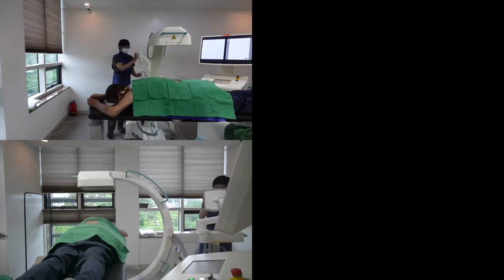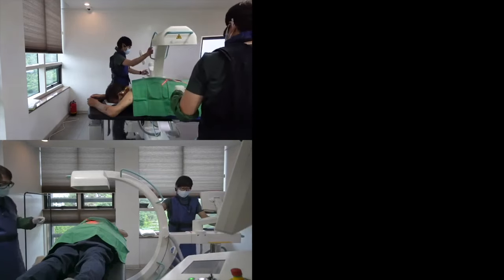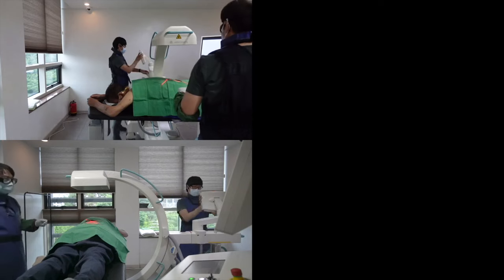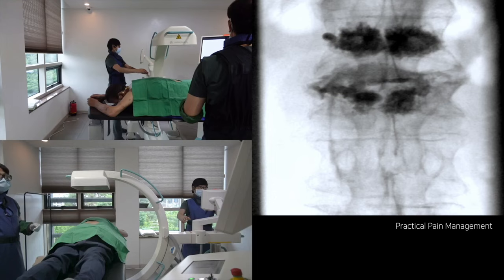Hello, I am Dr. Li of Practical Pain Management. Some doctors asked me about the C-arm angle in different procedures and levels. Unfortunately, I couldn't tell the degree of cranial or caudal tilting and rotation because of individual variations. These sessions will show how much rotation and tilting I need to find a target and approach the needle.